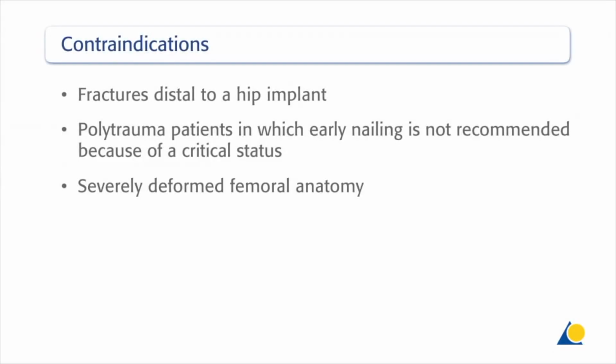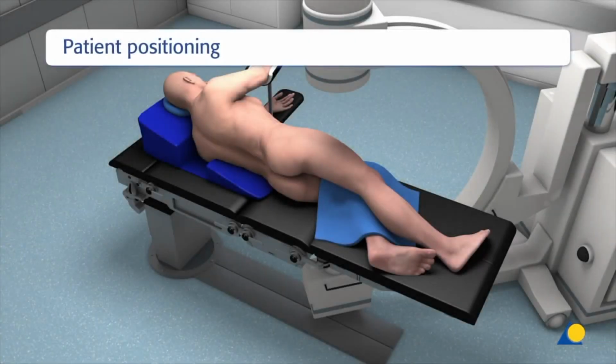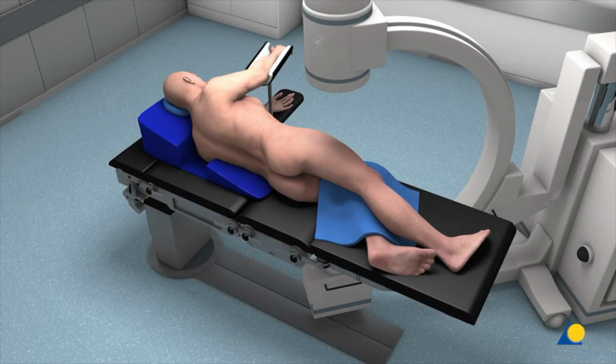Contraindications for the use of RAFN nails in the antegrade procedure include cases where there are fractures distal to a hip implant, polytrauma patients in which early nailing is not recommended because of a critical status, and severely deformed femoral anatomy. The patient is positioned in either the lateral decubitus or supine position on a fracture or radiolucent table.